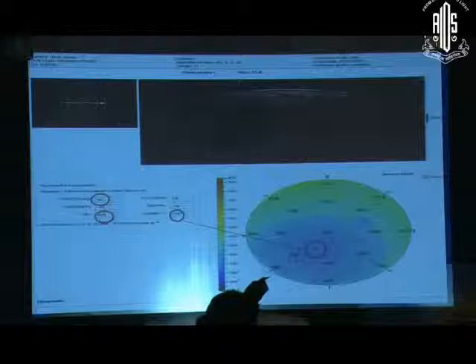This is a case of keratoconus. The pachymetry is 435 microns and the superior-nasal to inferior-nasal octant difference is 61 microns, which indicates keratoconus.